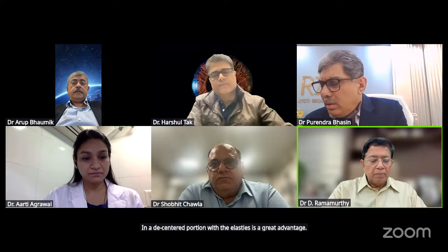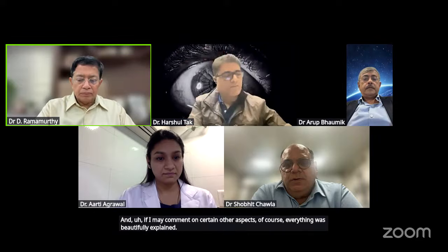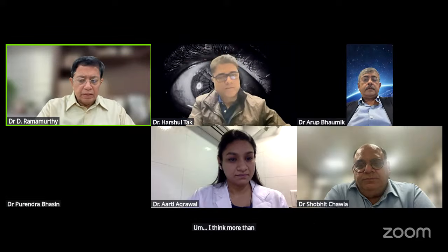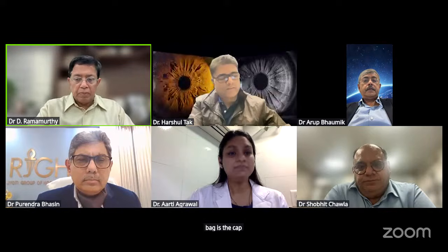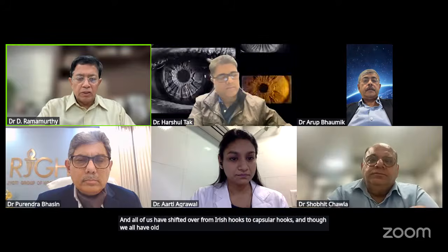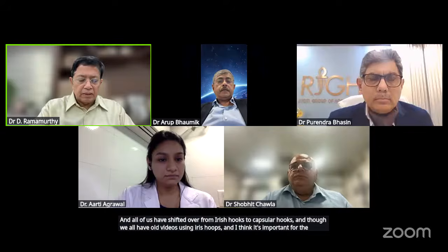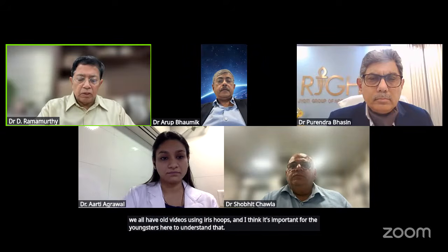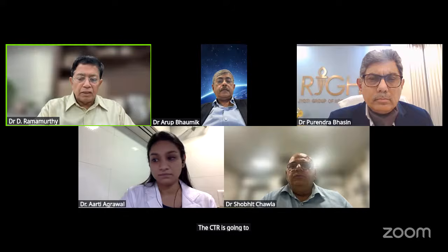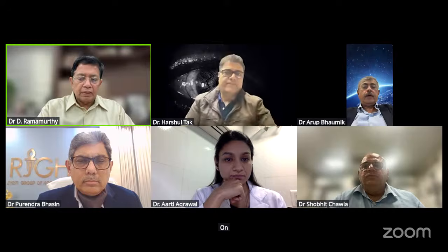And if I may comment on certain other aspects, of course, everything was beautifully explained. I think more than the CTR, in the initial cases for stabilization of the bag, it's the capsular hooks which play a very important role. All of us have shifted over from iris hooks to capsular hooks. Though we all have old videos using iris hooks, it's important for the youngsters here to understand that the CTR is going to offer only circumferential support. But as far as the stabilization of the bag on the table is concerned, it is the capsular hooks which play a very important role.